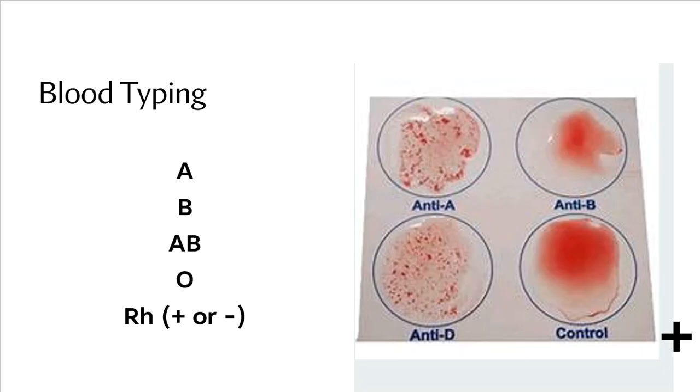It's all about blood. So blood typing, if you've made it into that lecture material, will come in the form of either blood type A, blood type B, blood type A and B both, or blood type O, which means you don't get A and you don't get B. You don't have either one. So A, B, and O, you have one of those. And this lab is going to force you to go through the motions to determine which one you have.